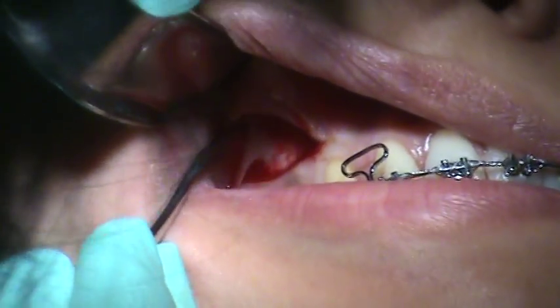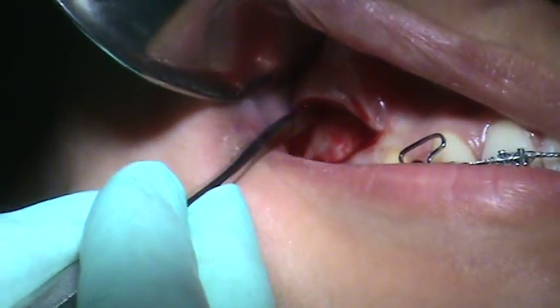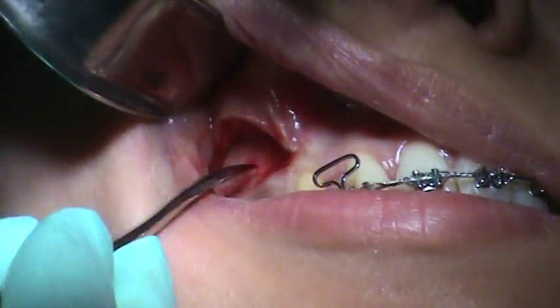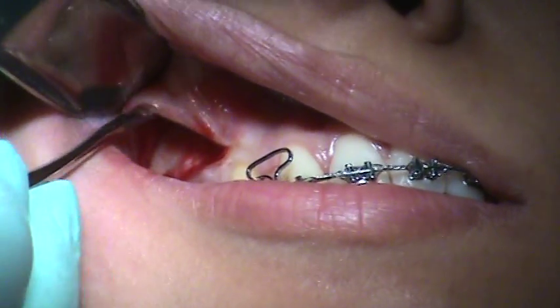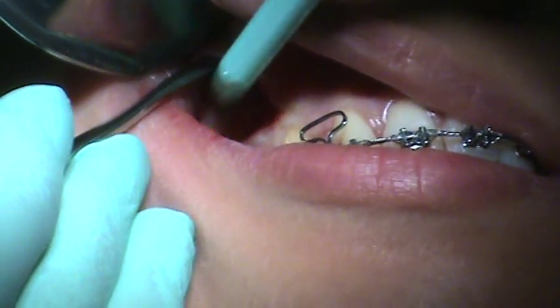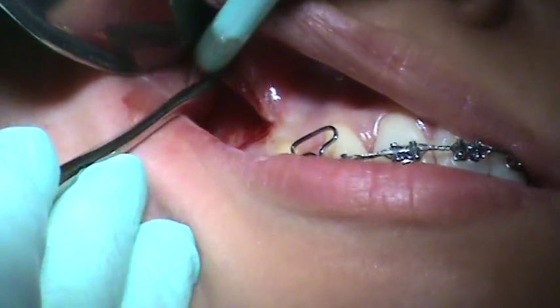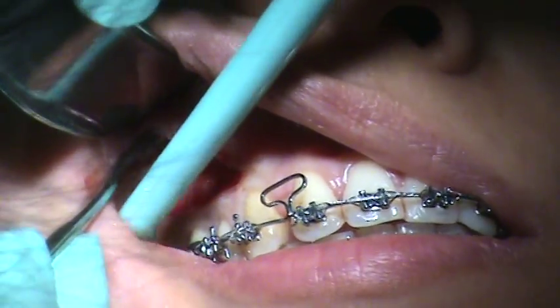A wide axis to make it easier to place the bone plate. The idea is to gain adequate bone and to also have a good line of force when retracting the upper teeth on the right side. The patient also has a slight midline shift to the left, so retracting on the right is indicated.